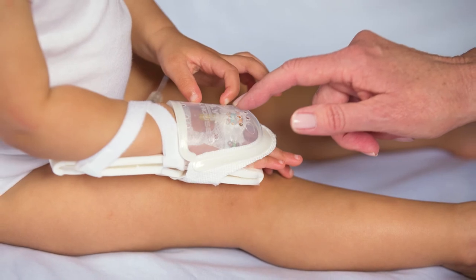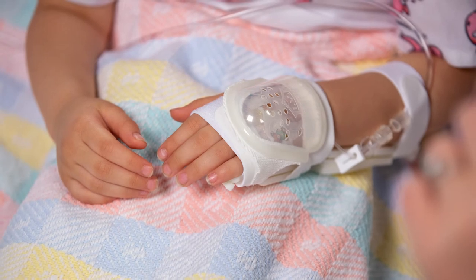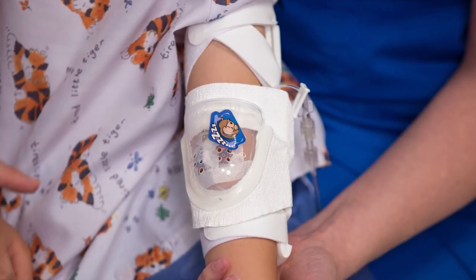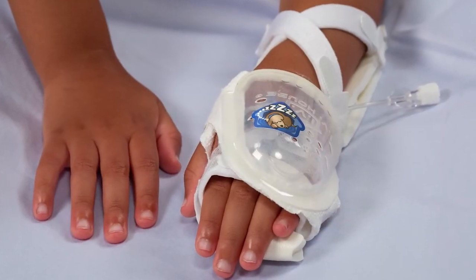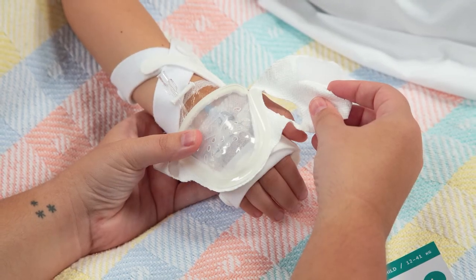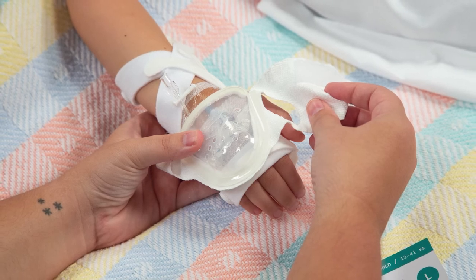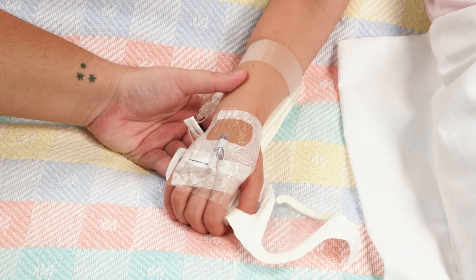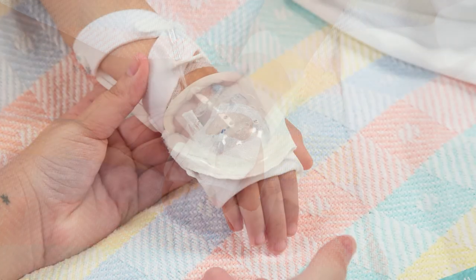From emergency department admission to hospital discharge, IV House products extend dwell time of the IV, reduce complications and costs. Properly protected IV sites will help eliminate unscheduled IV restarts and multiple IV attempts. Care and maintenance of IV sites is essential. IV House products are designed to provide instantaneous access to IV sites so nursing assessment can take place immediately.